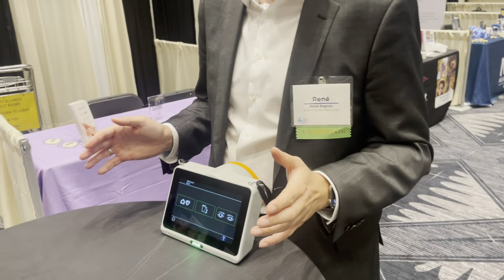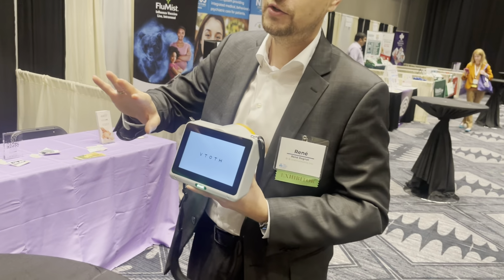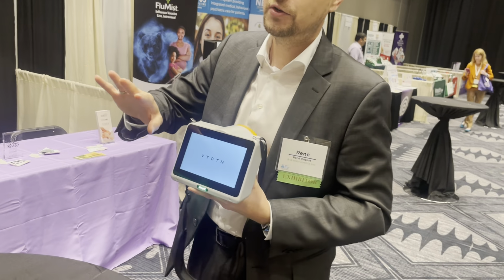Visual acuity, what I just told you about the wall chart. We consider our device like a digital wall chart. We can choose different sizes, and we would use it like this. We would go to a 10 feet distance, hold it at eye level, and then let the child cover their eyes, always with the palm, read 3 out of 5 right, that's perfect, you passed. Tap once, hit OK again, do it with the other eye, so it shuffles the optotypes. So even that, compared to a regular wall chart, increases your sensitivity and specificity like crazy, because you're making it harder. They cannot remember, because now it's a different order. Cancel, red X is always, we go back to where we came from.